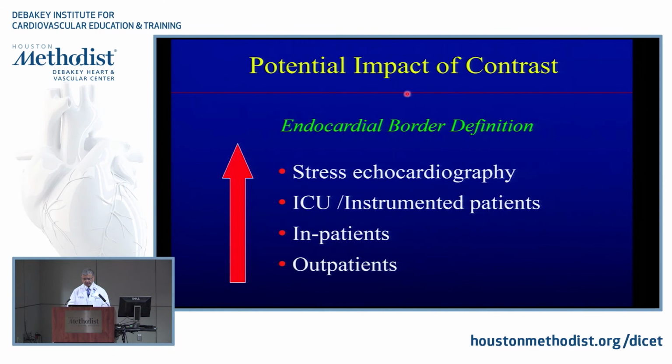Okay, this is about a 20-year-old slide that I haven't changed. And the impact is still the same as was. We didn't have data at that time, and now we have data to tell us that indeed the impact is highest in stress echo and ICU, and in patients in general less, but the least impact is in outpatients.